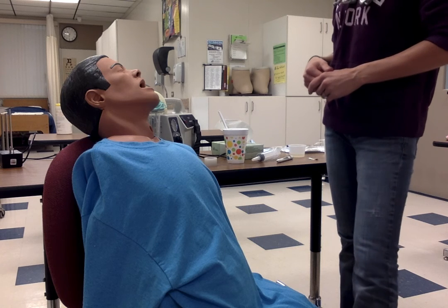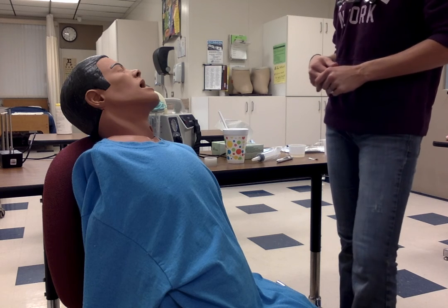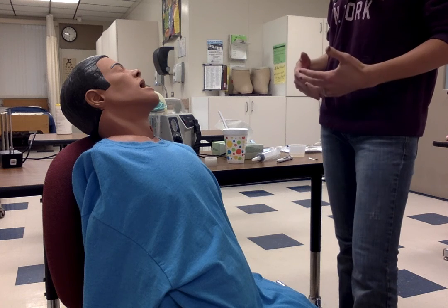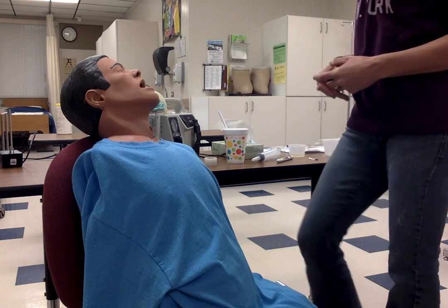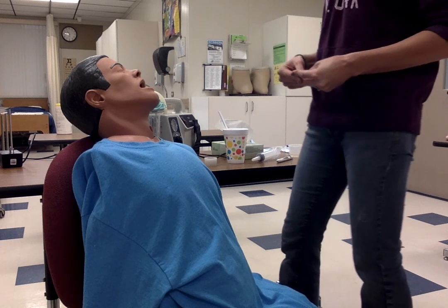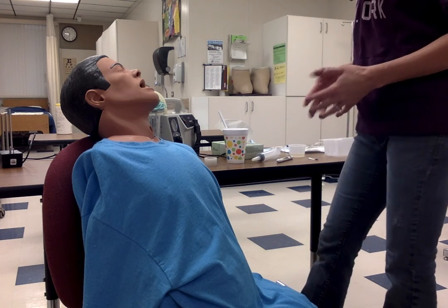I need to be honest, this is not a comfortable procedure to have completed. There's things you can do to help me get it in faster so that hopefully it's not as uncomfortable for you. But I will be honest, it's not a comfortable procedure, but it does not take that long. So hopefully we can go ahead and get that placed quickly. Patients are allowed to refuse this if they would want.